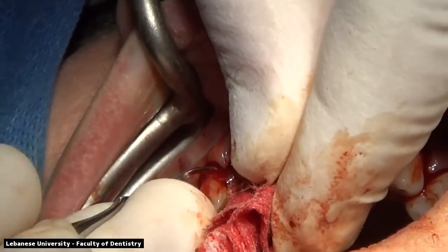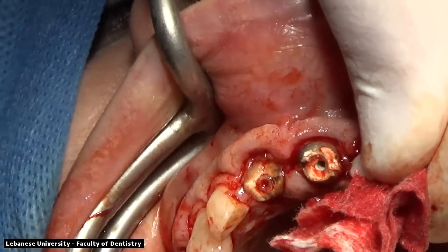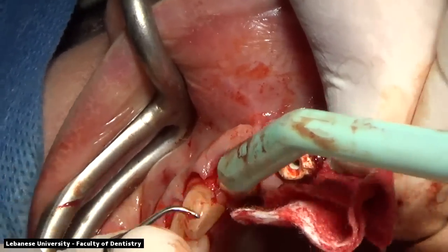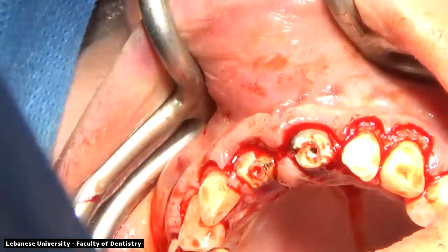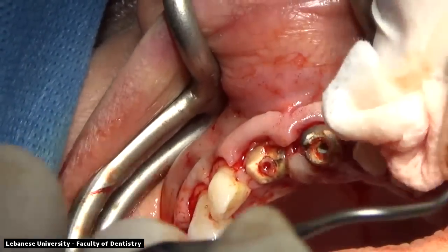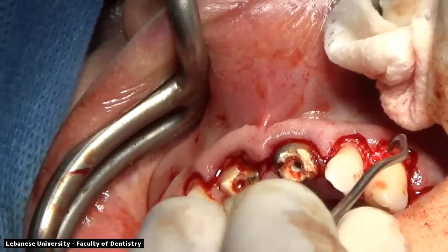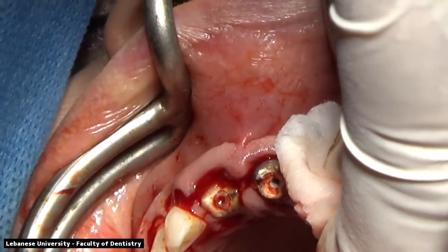Some root planing and removal of the granulation tissue is being done right now. We're using our Gracey curettes to do our scaling and root planing in this case.